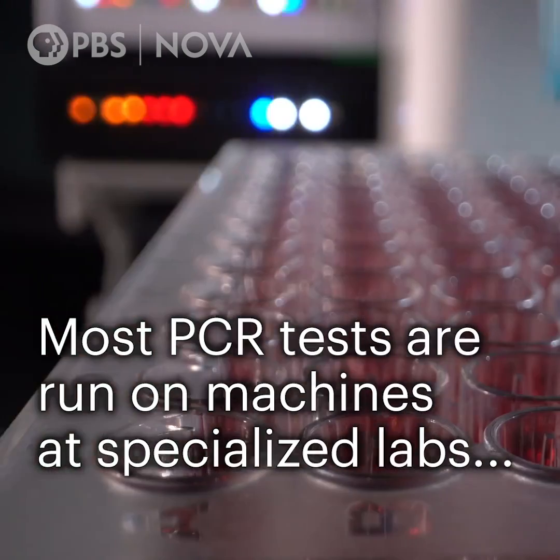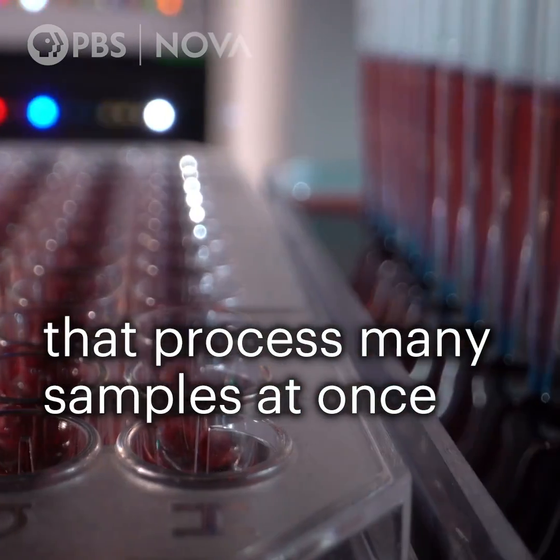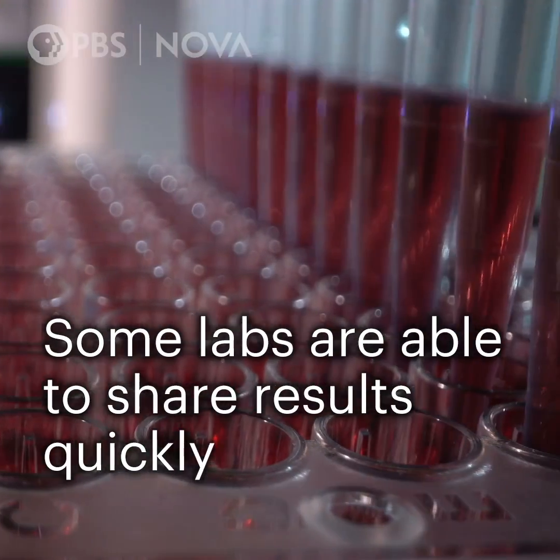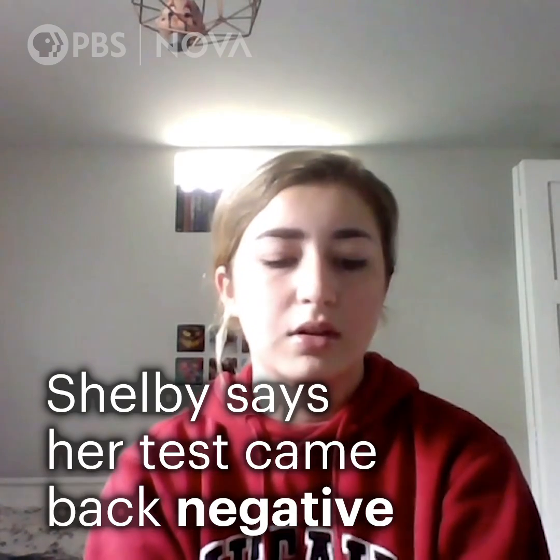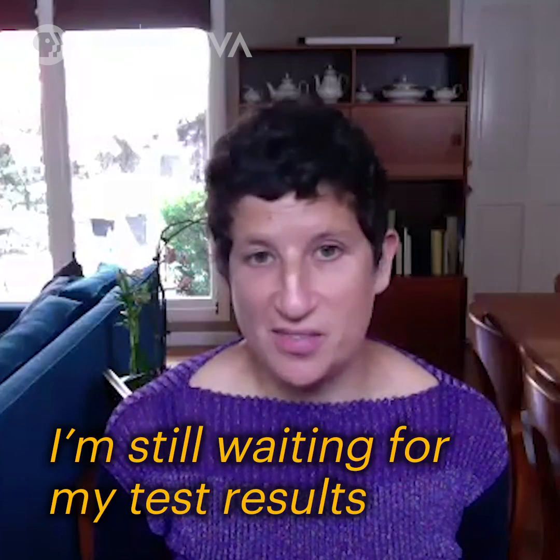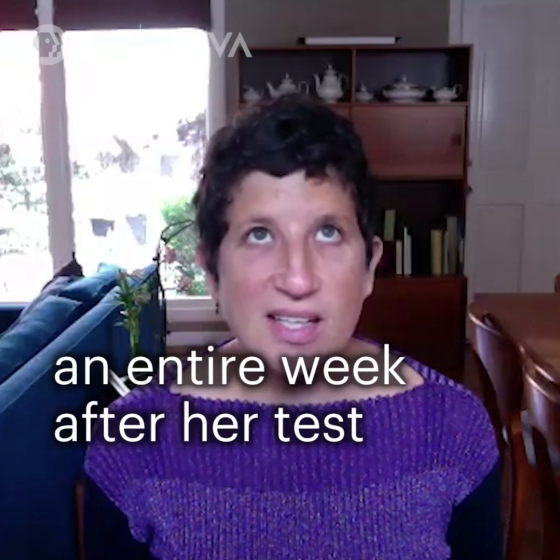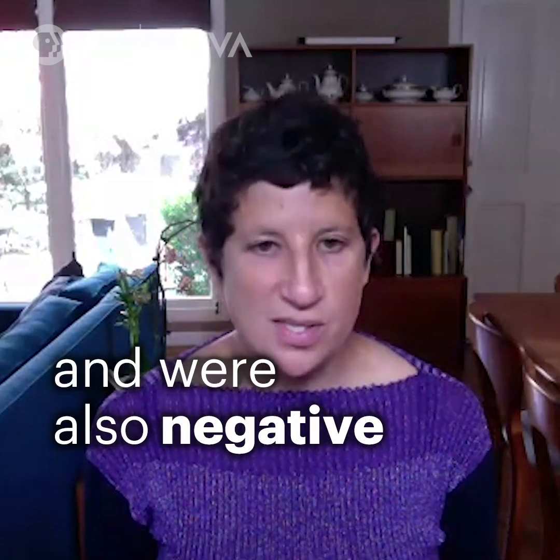Most PCR tests are run on machines at specialized labs that process many samples at once. Some labs are able to share results quickly. And I had mine in 18 hours. Shelby says her tests came back negative. No, I don't have it. Some results have taken several days. I'm still waiting for my test results. Sarah reports her results came back an entire week after her test, and were also negative.